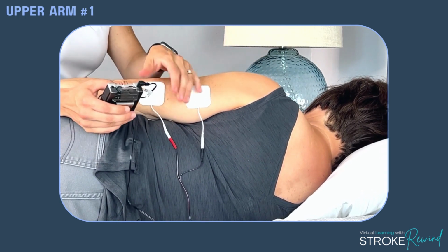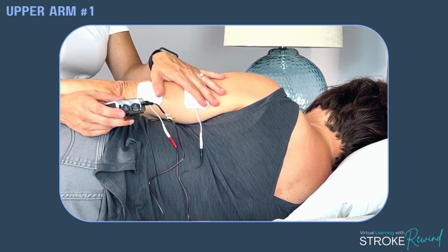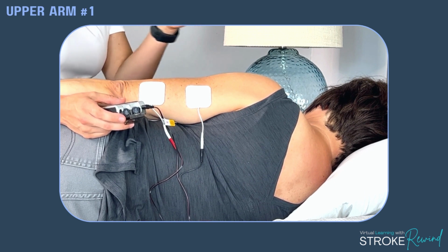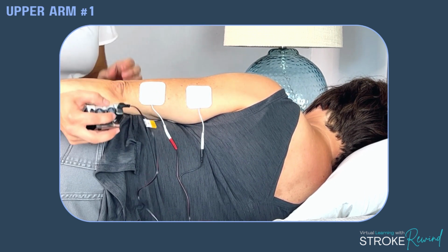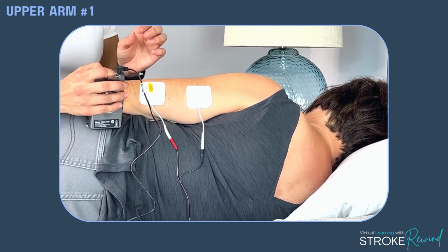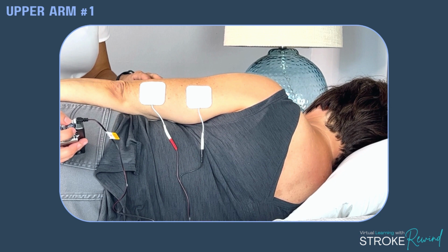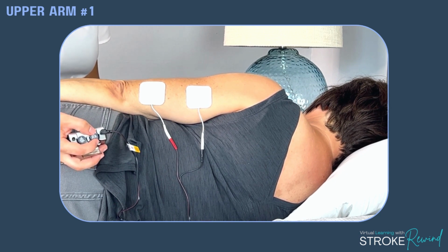So again, I put her on the side. The pattern here is to turn it on, ask when they can feel it. Once they can feel it, then try to get it to the point where you see a movement in the muscle. So she is not able to move her arm. I'm going to turn on the machine. So I'm going to let her know I am turning on the machine. Okay. Let me know when you can feel it. I can feel it. Okay, you can feel it now.